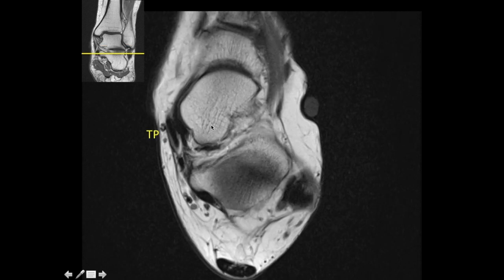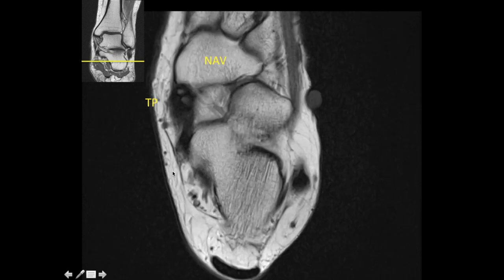The tibialis posterior tendon has a wide attachment to the navicular bone, and the two osseous structures within the tibialis posterior tendon are the accessory navicular bones.